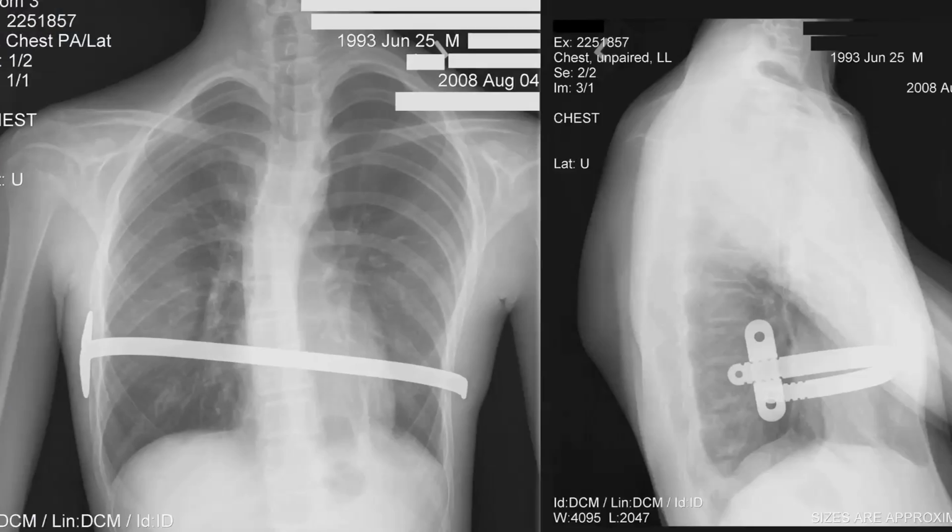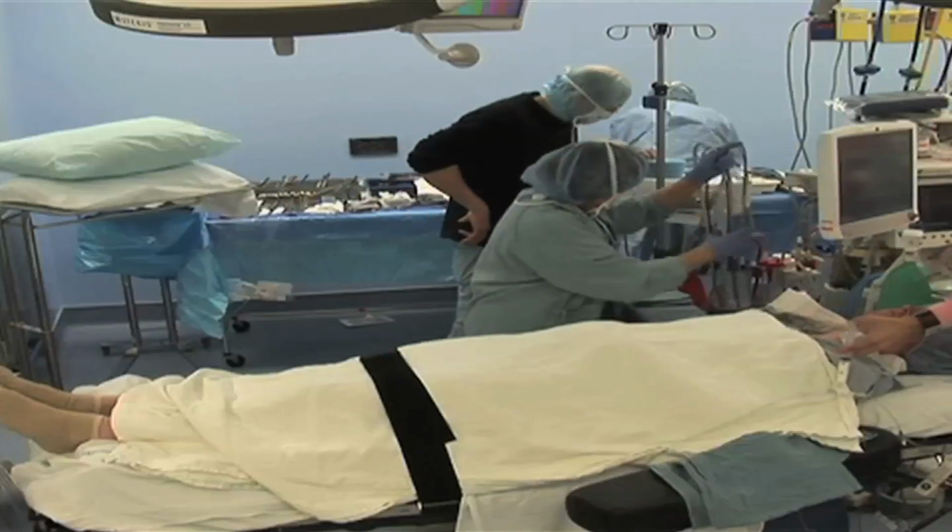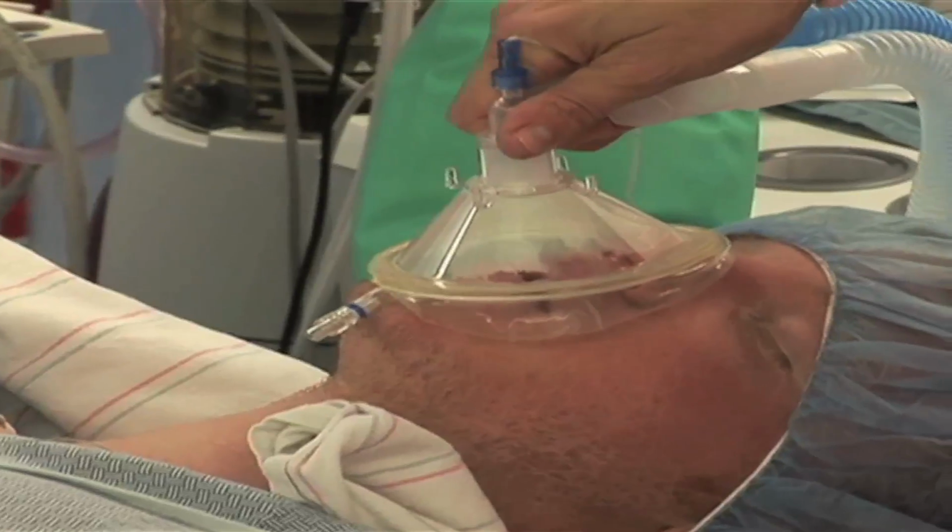The patient usually stays in the hospital somewhere between 4 and 5 days, and the bars stay in place for 3 years. It's during this 3-year process where the force of the bar on the chest causes the abnormal cartilaginous ribs to literally reshape themselves. The chest then achieves a permanent corrected position, allowing the bar or bars to be removed under general anesthesia as an outpatient procedure 3 years later. The chest remains in that corrected position.